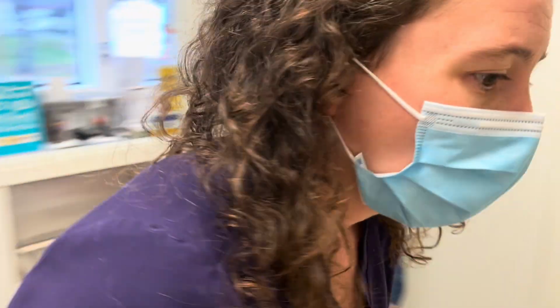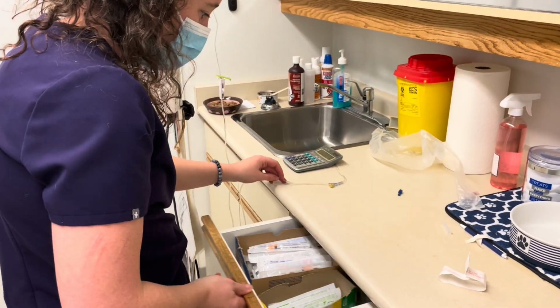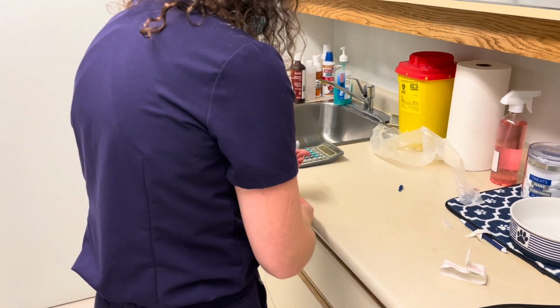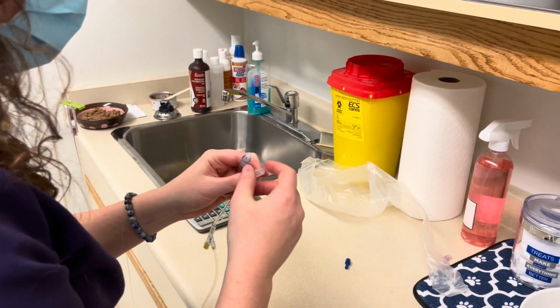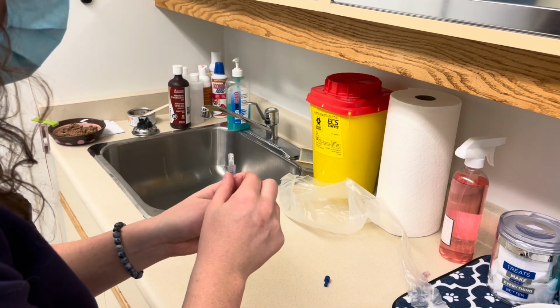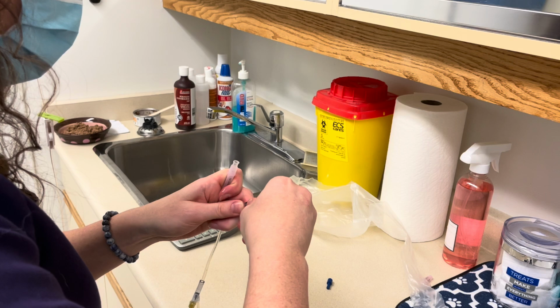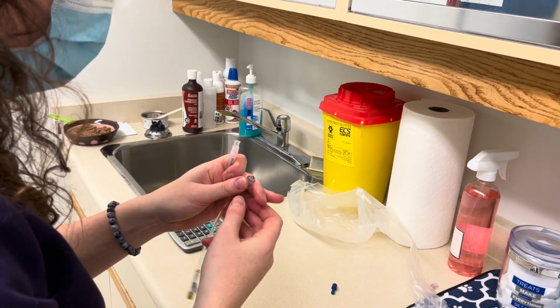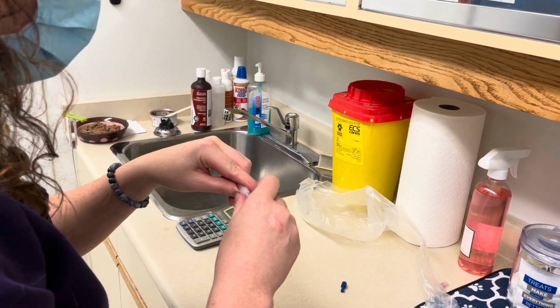So what we're gonna do for the next part of our video here is we're just gonna take a needle. So we're gonna take a needle right here. And what I need to do is I need to remove this part. So I'm removing this here, needs to be removed. And I've got a 20 gauge needle and I'm not touching the end of that. And I take the end of this off. Now, I need to connect these just like this, and then you screw it on.